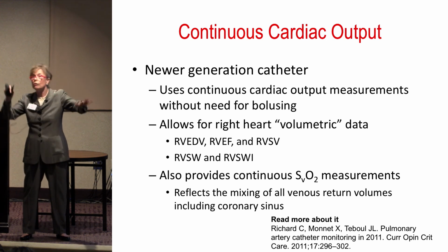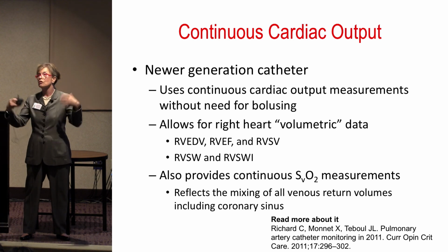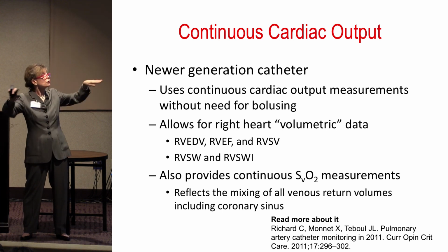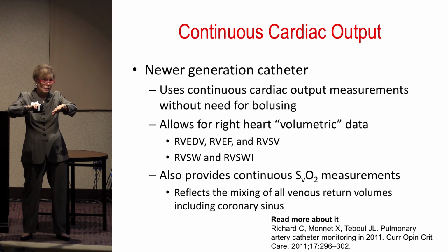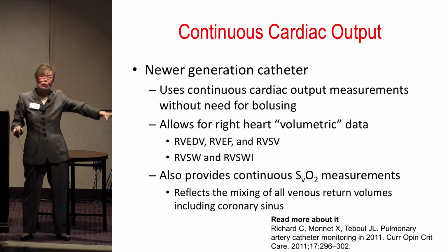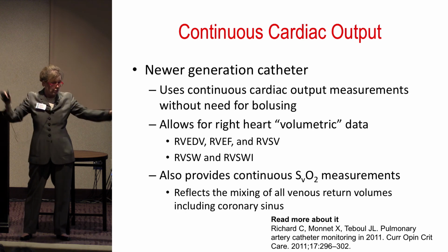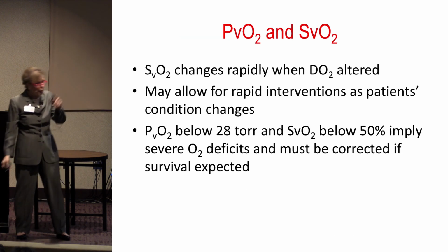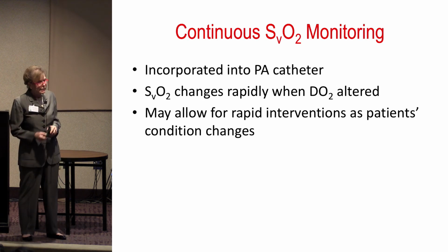And what I'm going to try to do is manipulate my ventilator settings, my volume resuscitation, and my inotropes in order to equalize that blood flow dynamic. Because what we traditionally see, if we have a PA catheter and an arterial measure, is a wide gap between those measures. One is the right heart, the other is the left heart. Probably not going to convince anybody about how important this is, but it is important to me.